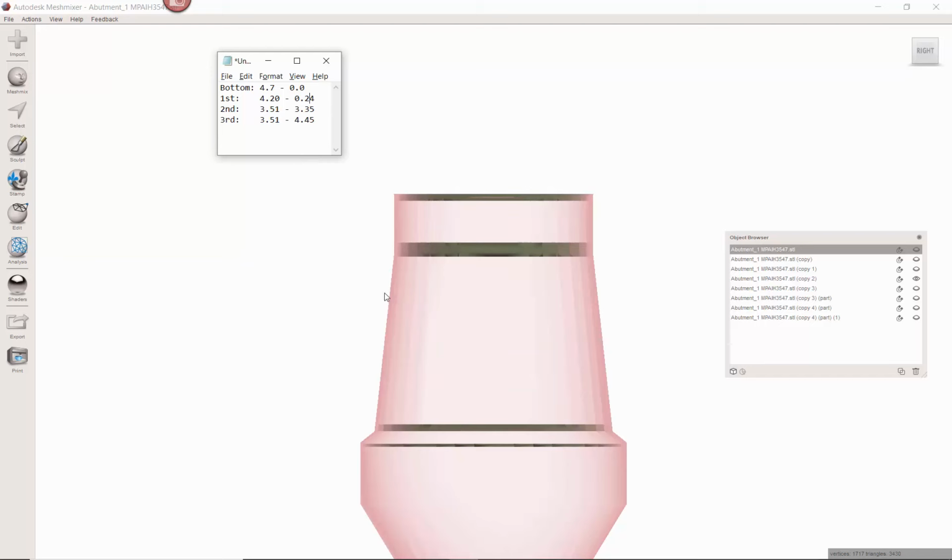Now, every abutment might have just a straight line from here to here. Fine, this is one less thing you need to measure. It might be convex as opposed to concave. You have to measure that. Anywhere that's this concave part, you could just create an abutment that went straight from here to there, skipping this part. It would just be more loose and more cement would fill that in. But if it was convex instead, where it stuck out, that would be very important, or your abutments won't fit, or your printed healers won't fit.